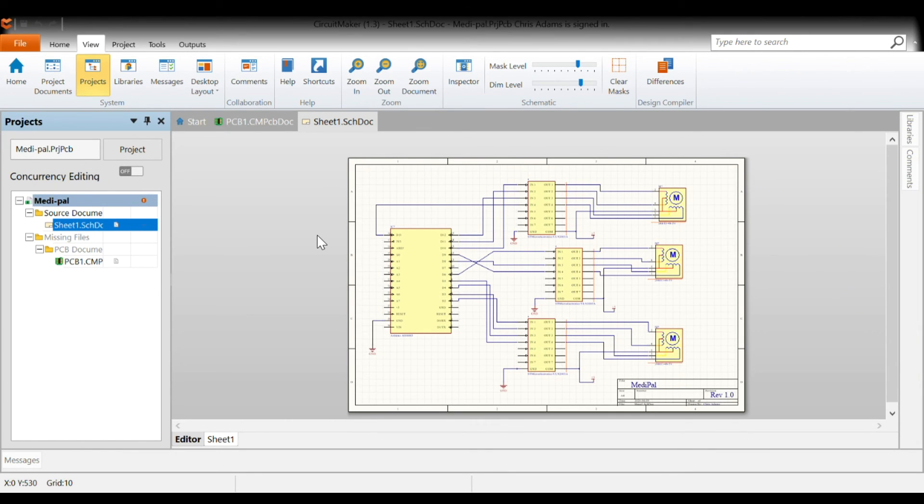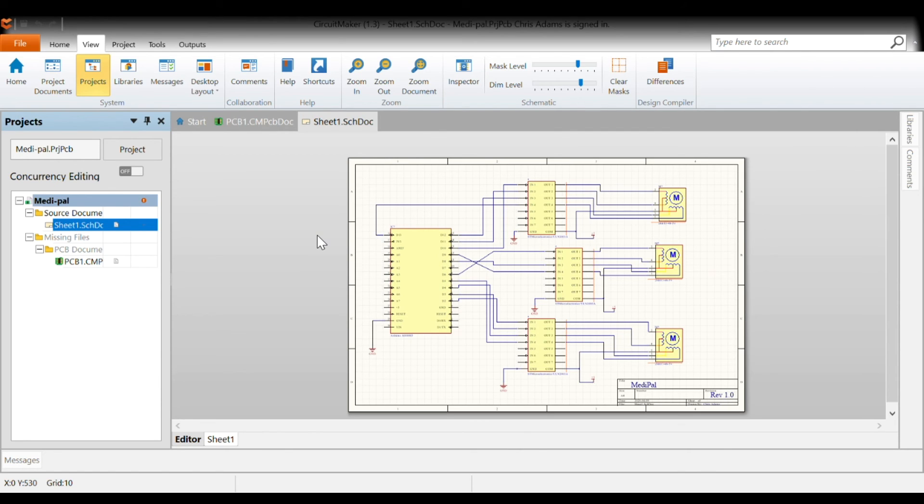A couple other design choices that really allow us to optimize our space as well as power consumption. Here is a simple circuit diagram illustrating the MediPal. As you can see, controlling the three stepper motors using the ULN drivers requires four digital pins each, for a total of 12.